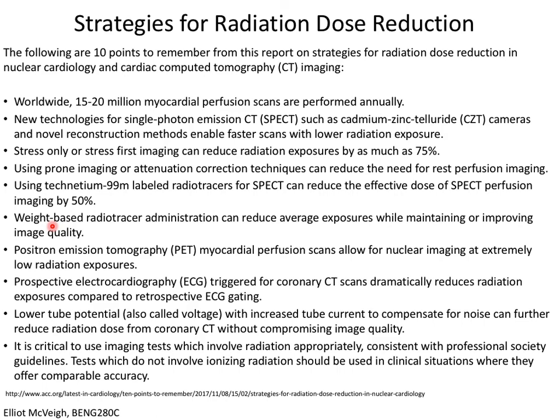So these are just points for you. I won't read them out, but a big deal for SPECT is reducing radiation, because it turns out a rest stress SPECT scan can be upwards around 20 millisieverts of radiation. And remember that your baseline radiation that you get each year just by walking around being alive is 3 millisieverts. And so there's obviously a cost-benefit thing. 20 millisieverts is still not a lot of radiation for somebody who you really need to know whether or not you should treat their cardiovascular disease, because that's a much higher risk operation.